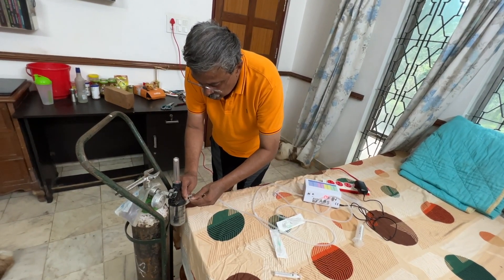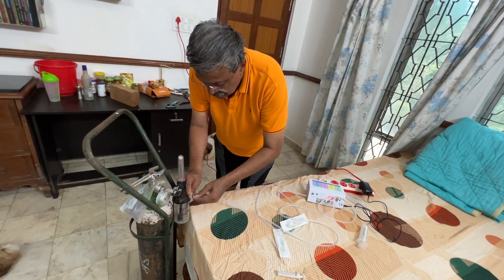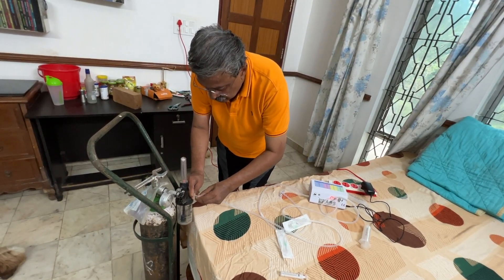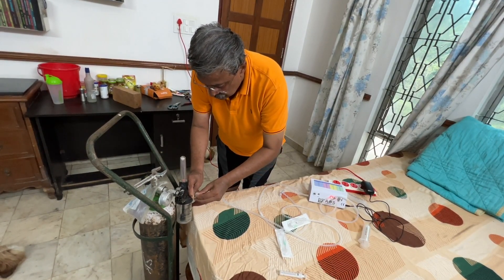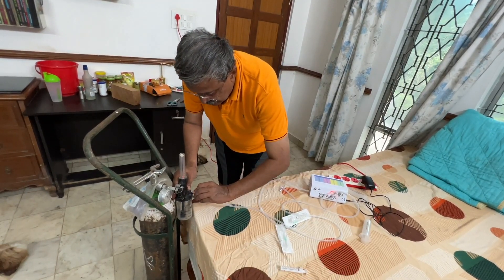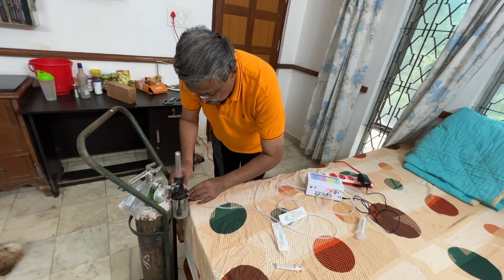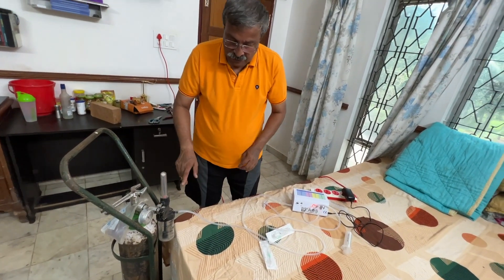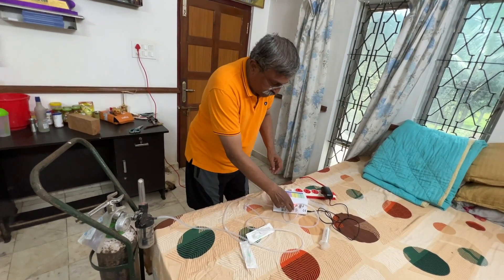Here we are showing the fixing with a conventional pressure gauge, which does not give 1/16th or 1/32nd of a liter of oxygen. However, in the picture shown before and in the products that will be available to the doctors, we will have a different type of adapter.